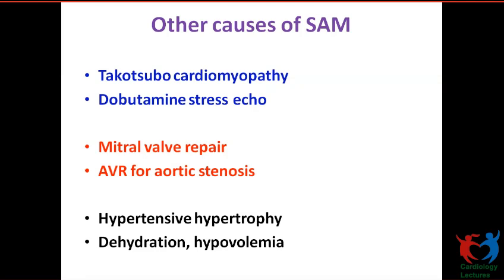But earlier it was classically described in HOCM, correct? That's what is given in Tajik's echo also. We discussed that day.